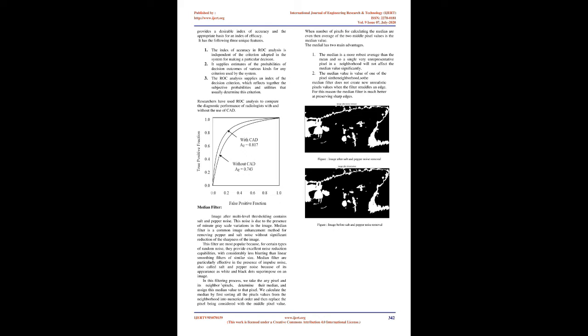Motivation of CAD system. Nowadays the CAD system has become a major research area in the field of medical imaging and diagnostic radiology. CAD is a concept established by taking into account equally the roles of physicians and computers. A CAD system works as an assistant to the radiologist for final diagnosis of lung cancer. In fact, a large number of CAD systems have been employed for assisting physicians in the early detection of lung cancer in X-ray images. Recently, computer-aided diagnosis has become part of routine clinical work for detection of breast cancer on mammograms and lung cancer in X-ray images at many screening sites and hospitals. In the United States, this seems to indicate that CAD is beginning to be applied widely in the detection and differential diagnosis of many different types of abnormalities in medical images obtained in various examinations by use of different imaging modalities. Even though CAD is a well-developed clinical tool for diagnosis, it is still in its infancy and much work needs to be done.